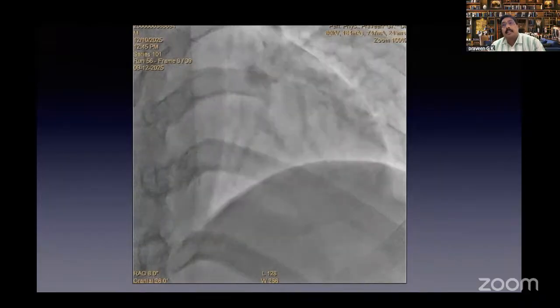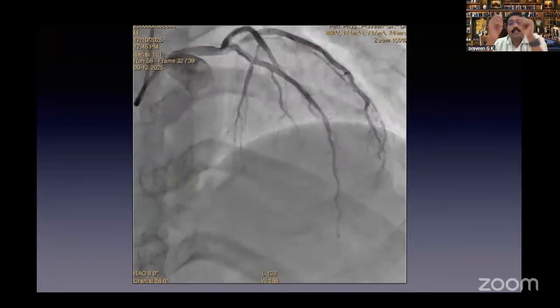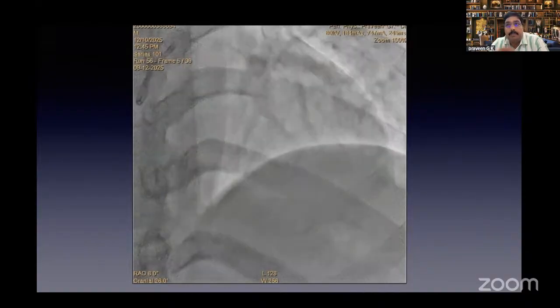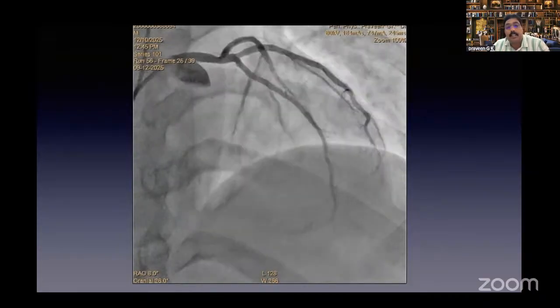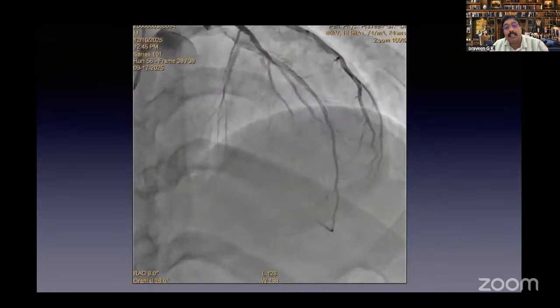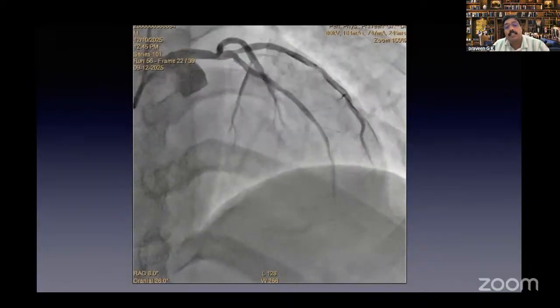So from my limited experience, what I have felt is that it's an excellent stent with good trackability and utility. What I find most useful is, especially while you do an overlapping stent, you can precisely do the overlapping without taking much stent boost or stent enhancements.